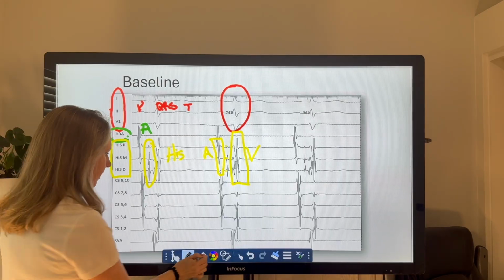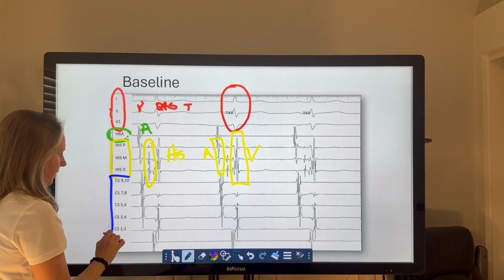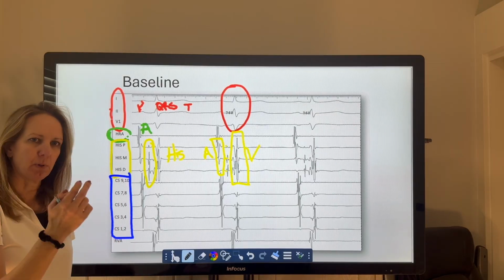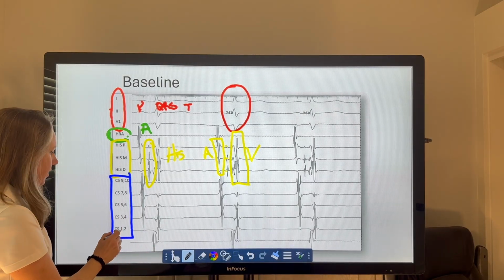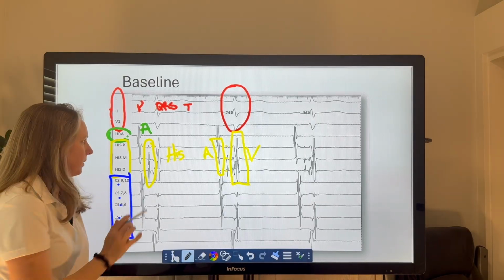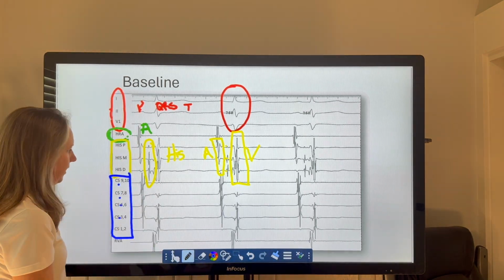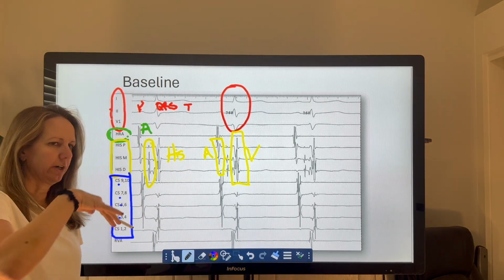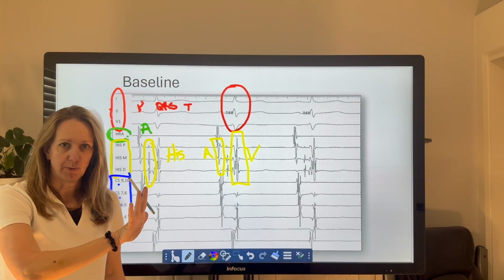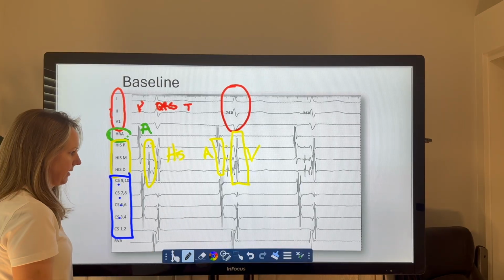Okay. Next, we have our coronary sinus. So decapolar, remember we're going to utilize those pairs. So with 10 electrodes, we get 5 channels with our standard setup. Our His catheter, we did a little differently to get 3 channels. All right, we remember our coronary sinus sits in between the atrium and ventricle, looping around to the left side of the heart on that posterior aspect.